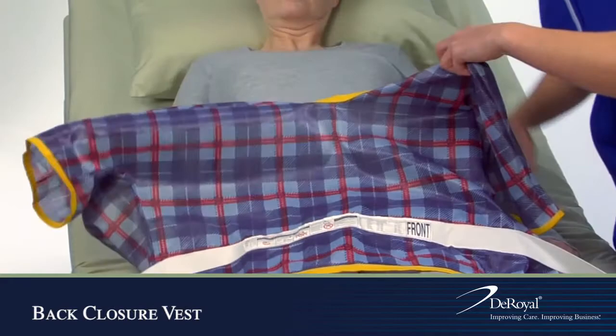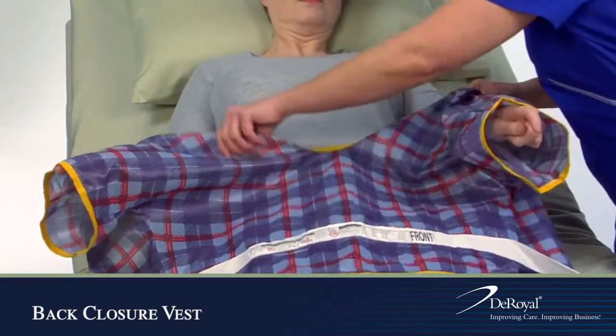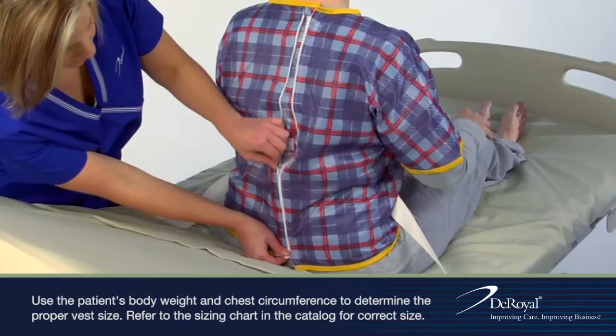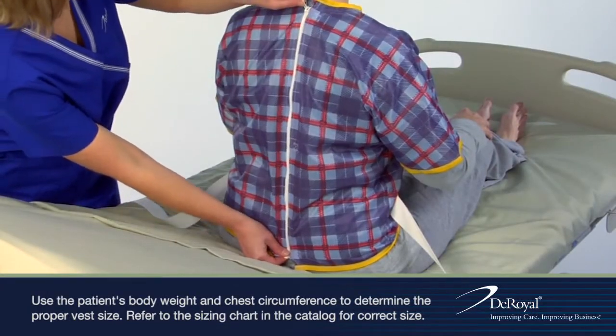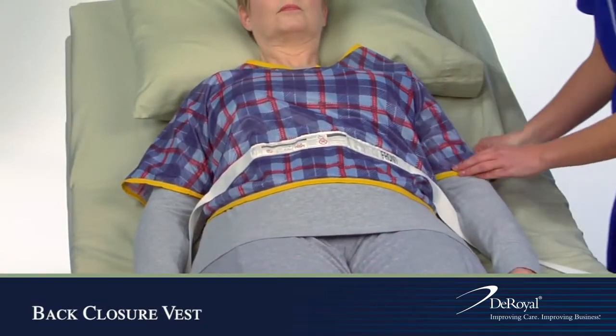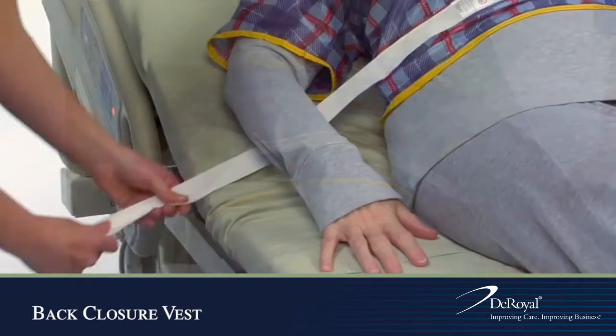Place the patient's arms through the sleeves, secure closure in back, and secure the straps to the bed or wheelchair.